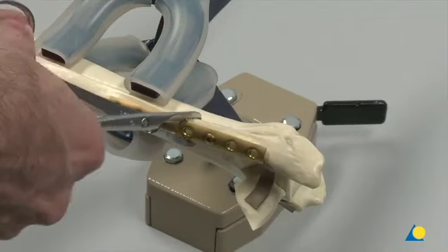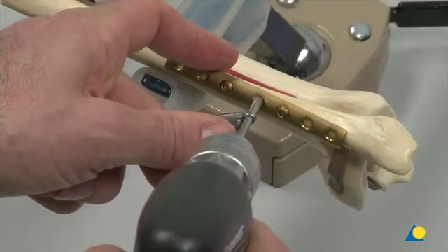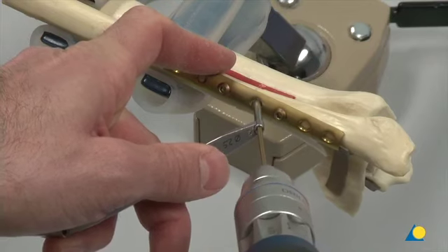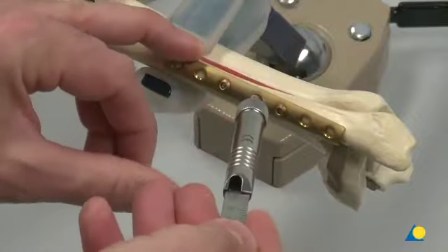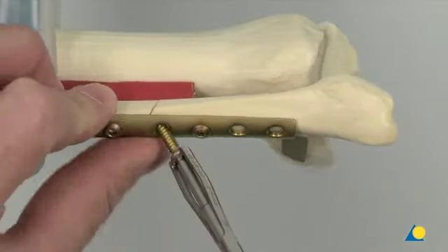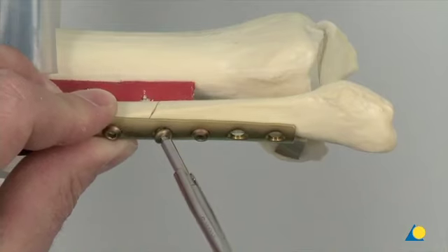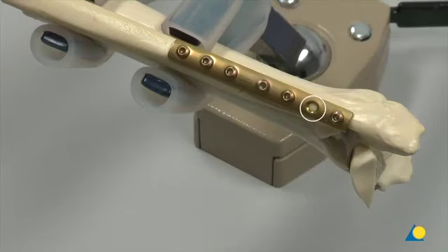The toothed reduction forceps is removed. The glide hole is drilled for lag screw insertion using the 3.5 mm drill bit and drill guide through the near cortex only. A thread hole is drilled through the opposite cortex using the 2.5 mm drill bit and drill guide. The required length of screw is measured using the depth gauge. The 3.5 mm self-tapping screw is inserted, functioning as a lag screw. All remaining plate holes are filled except for the 2nd distal hole, which will be used later for the position screw.